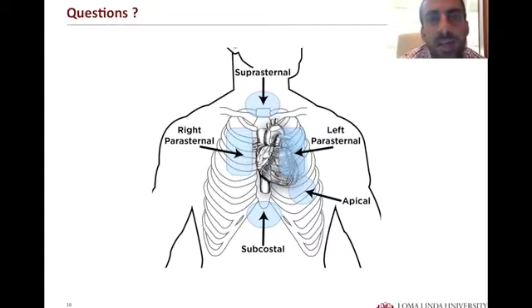Okay, so hopefully the key take-home point with the subxiphoid space is identifying the liver to insonate the heart, and then once you have the heart in your ultrasound screen image, you want to adjust your tilt, rotation, and angle to get different cross-sections of the cardiac structures to produce images that can be very similar to the parasternal and apical windows.